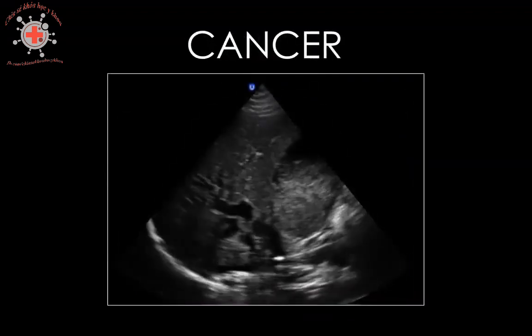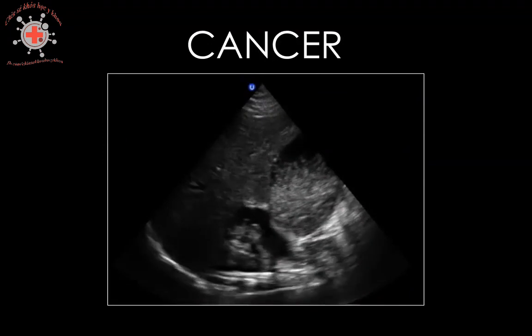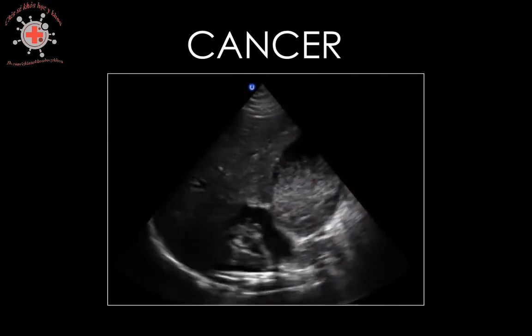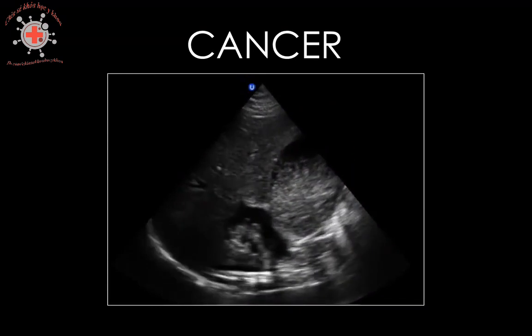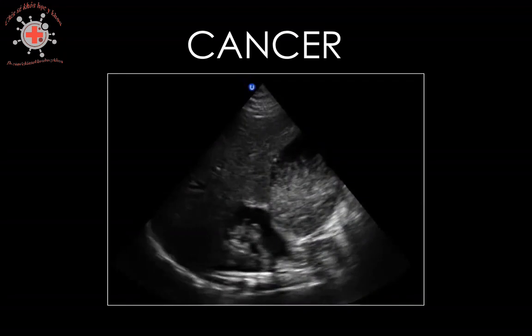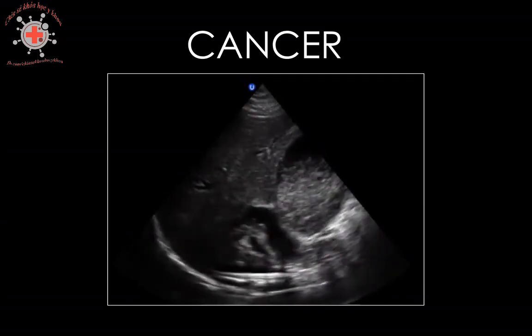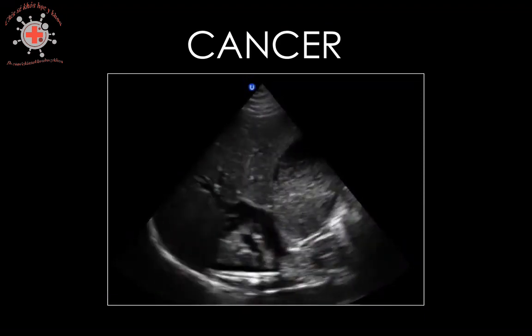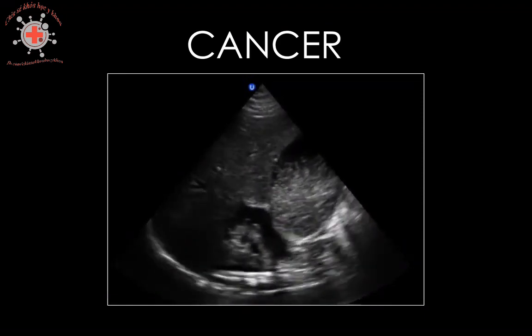This video is from a patient who presents with jaundice and a non-tender abdomen. Notice that the gallbladder is enlarged and that echogenic material in the gallbladder is immobile. This is gallbladder cancer. It is a rare malignancy that is difficult to diagnose until its advanced stages due to a lack of symptoms. Development of this cancer is correlated with the presence of gallstones, and it has a very poor prognosis. That's biliary pathology.